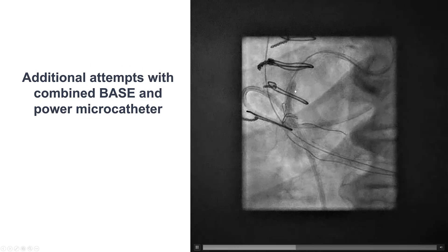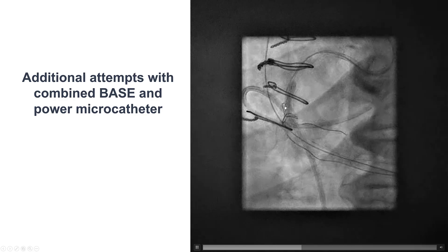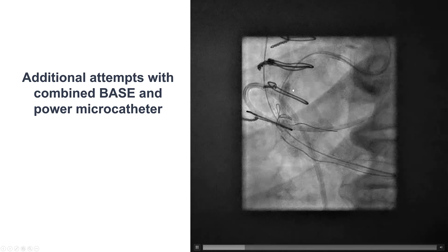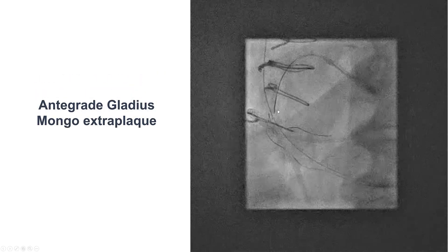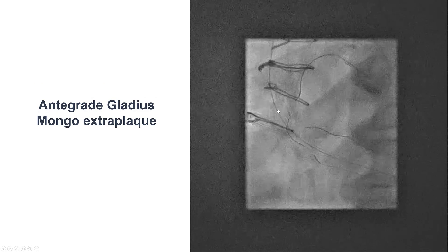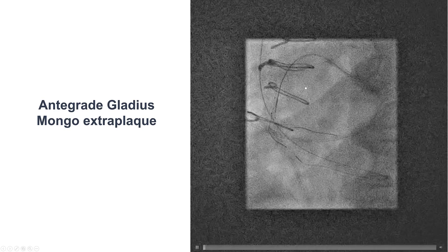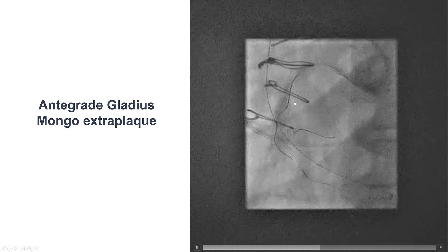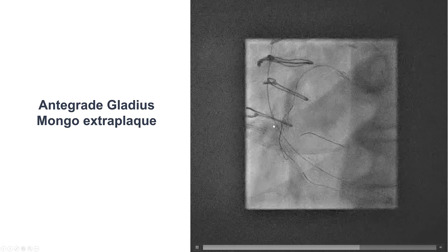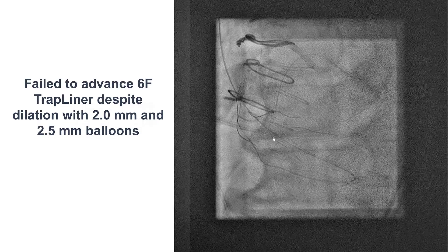We used the BASE technique again with an antegrade microcatheter, attempting to direct the wire into the extraplaque space without success. But then eventually, using multiple balloon inflations, we were able to advance a Gladius Mongo antegrade wire next to the retrograde guide wire into the extraplaque space.